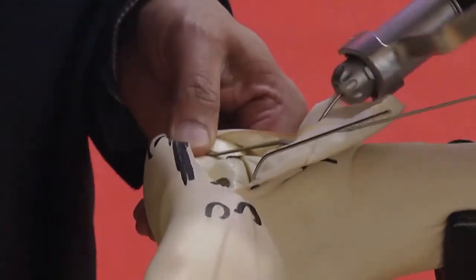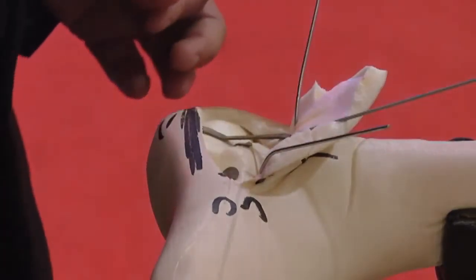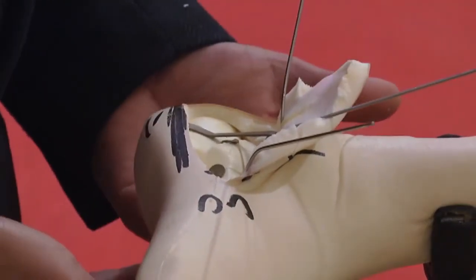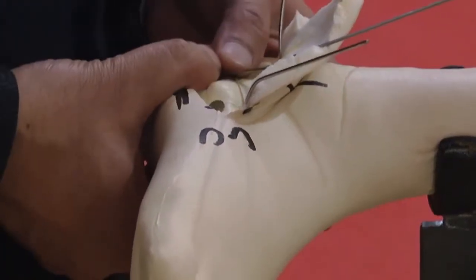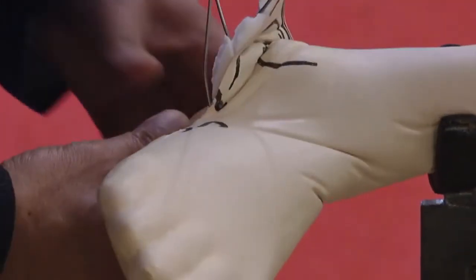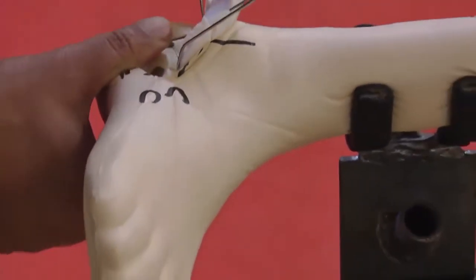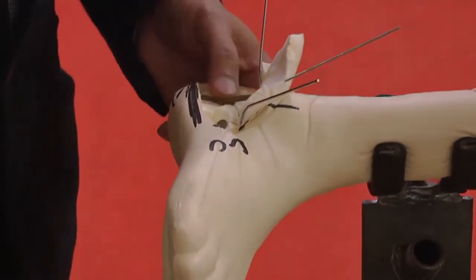So that exposes your lateral surface as well as the subtalar joint. Now, at this point, if you want to look inside, you have a bump in place here. That bump is moved onto the leg, the heel is now free. And if you do this maneuver on the table, you see directly into the subtalar joint. There's a lot of clot there. Need to remove that clot, wash it out to see the joint surface.